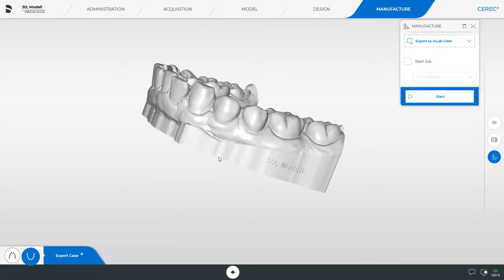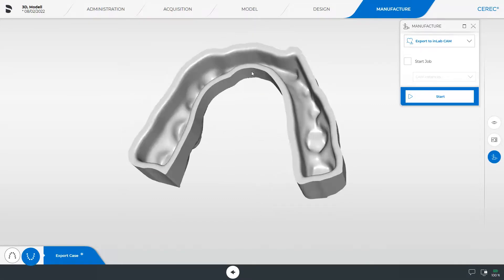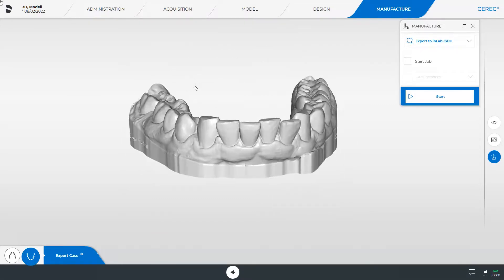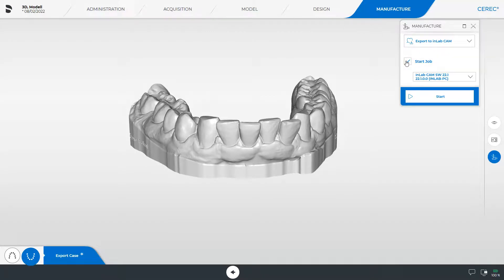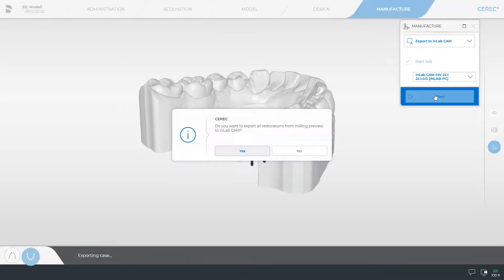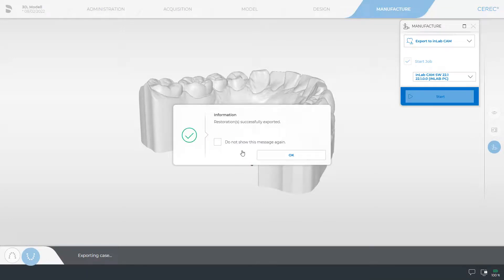Here we look at the solid model from all directions and place a check mark next to start job. Provided your PC with the installed InLab CAM software is connected to the same network as your acquisition center and it is turned on, the model data are automatically opened in the InLab CAM software when tapping start. By tapping yes, both models are exported, and a message confirming the successful export is displayed.